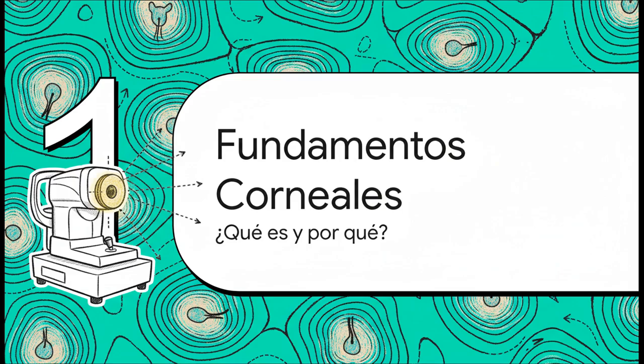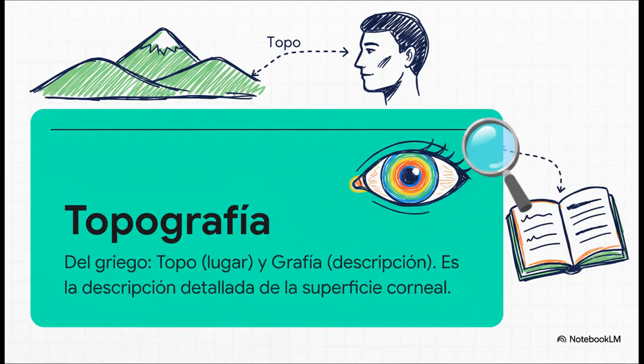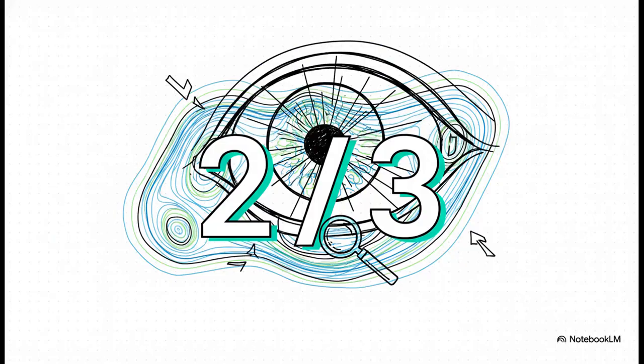What is corneal topography, exactly? And why has it become such an indispensable tool in our field? Let's build that foundation. The name itself gives us a fantastic starting point. Topography comes from the Greek words topo, which means place or terrain, and graphia for description. So we are literally describing the surface of a terrain. In our clinic, that terrain is the patient's cornea. And wow, what a critical piece of terrain it is.